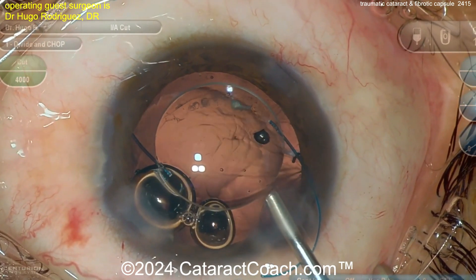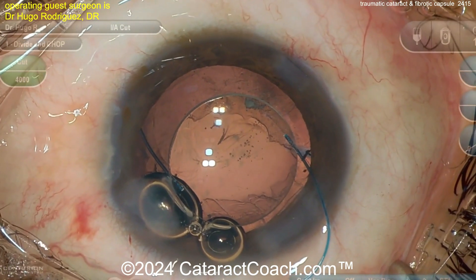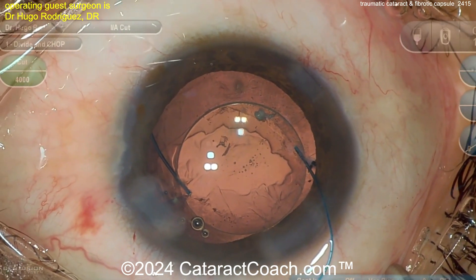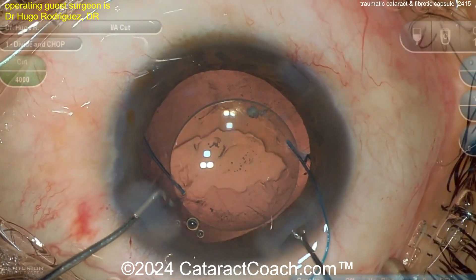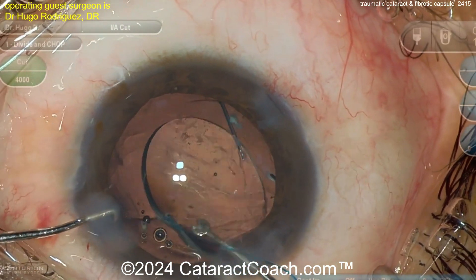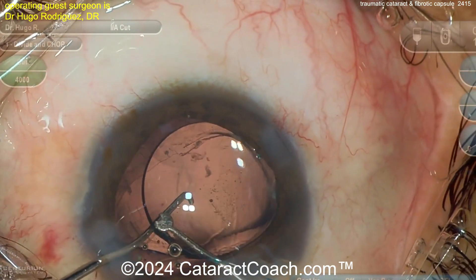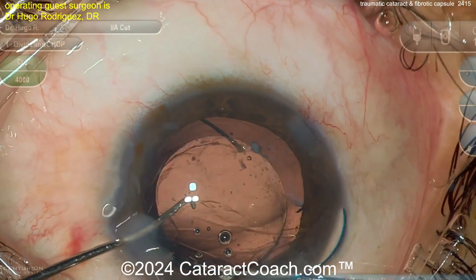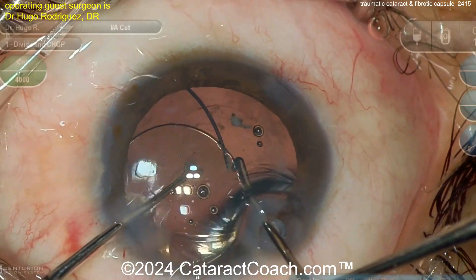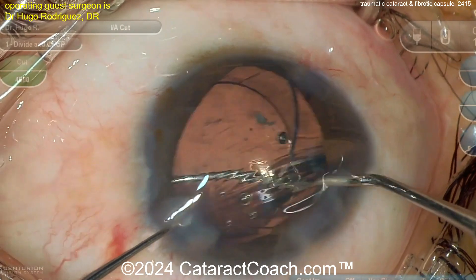Above the optic, below the optic — give yourself a good buffer. There should be enough room to get this thing flipped over. You definitely want to get that lens flipped over — right now it's upside down. If you're putting a sulcus lens, remember you have a vaulting of those haptics. Much better, because this is going to allow the lens to be posteriorly vaulted. Be careful — these haptics can actually puncture your posterior capsule, so take your time.